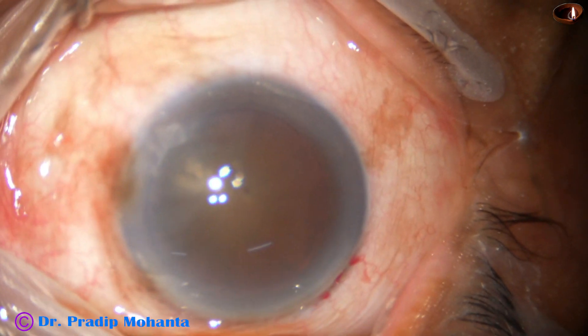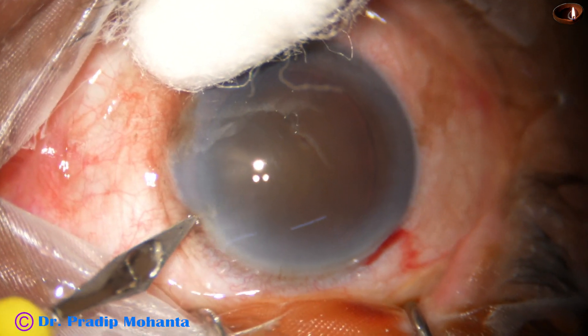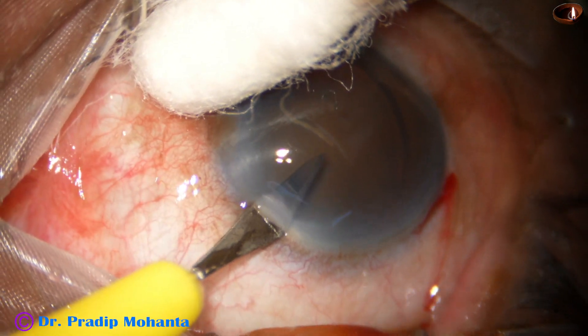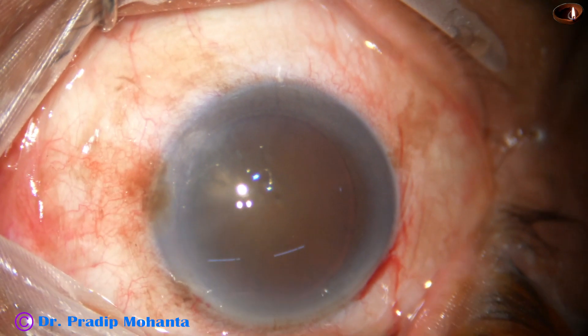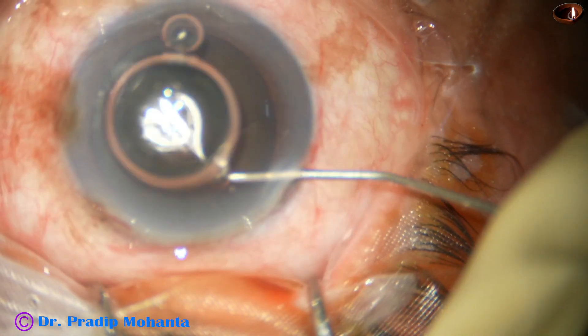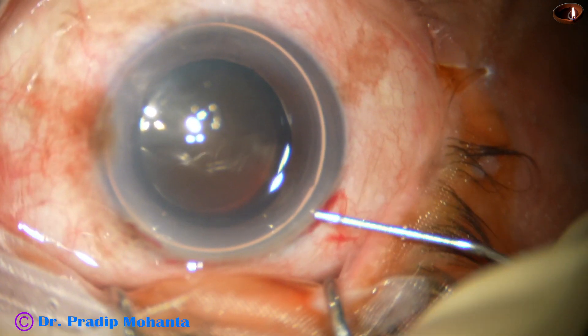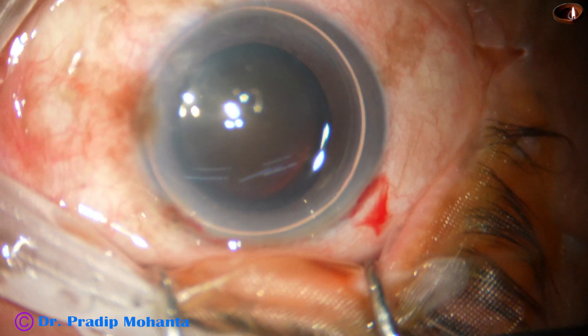This is a cataract with grade 5 nucleus sclerosis, a very hard cataract. The microscope is Lumera T with stereo coaxial illumination, and that is why we are having some red glow though the cataract is very hard.